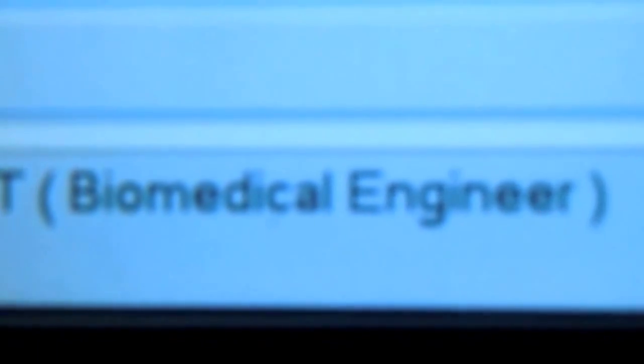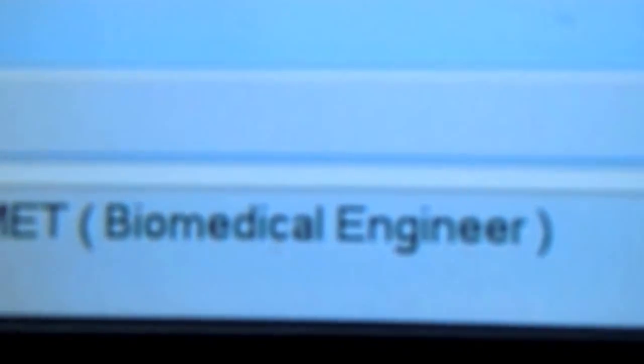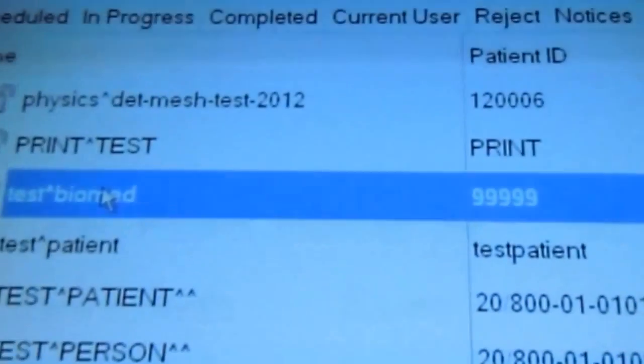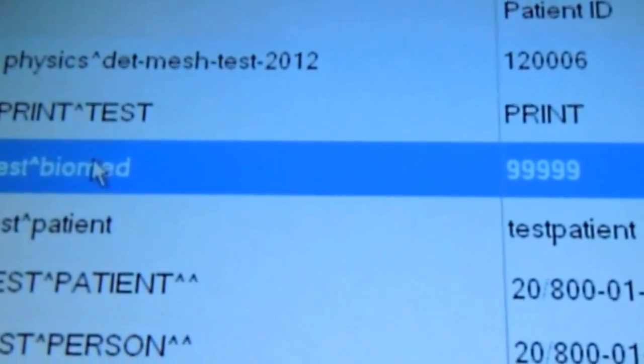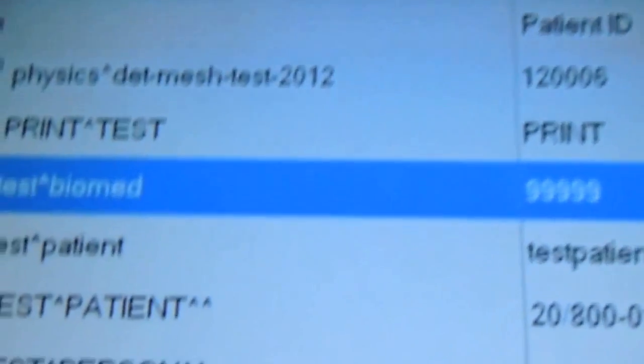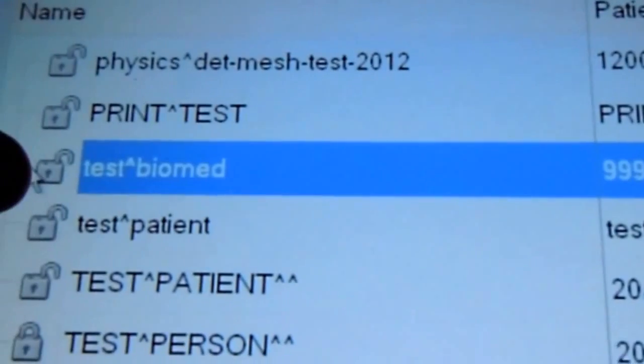We're at the login screen. We're going to log in using our finger scanner here. And we're logged in as biomed engineer. We're going to search for patient test. We've just done a search for test and biomed test.